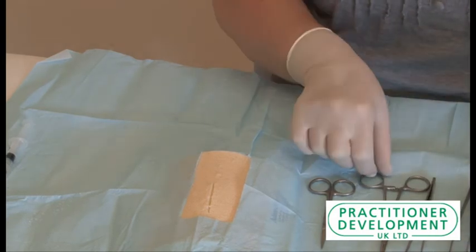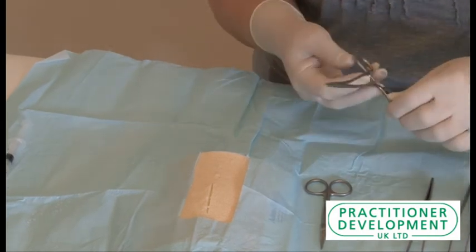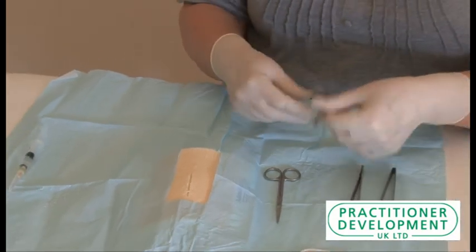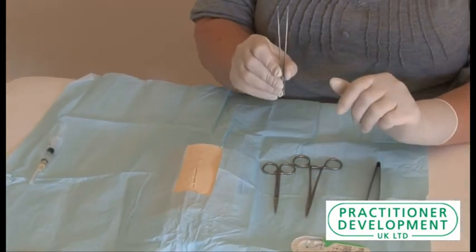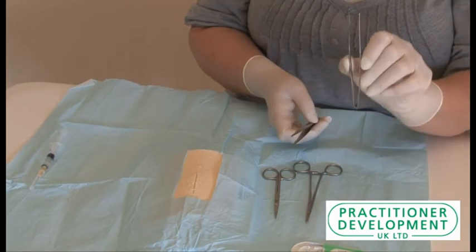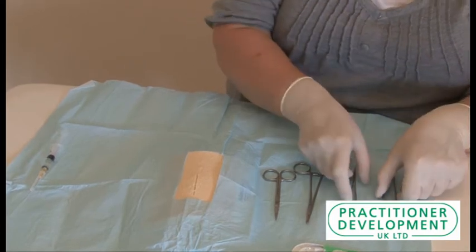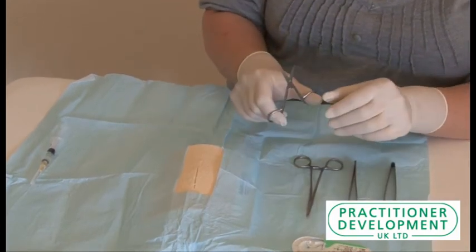The suture kit itself should have a needle holder, a pair of toothed forceps and a pair of non-toothed forceps, and a pair of scissors to cut.